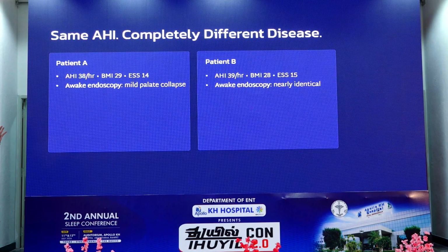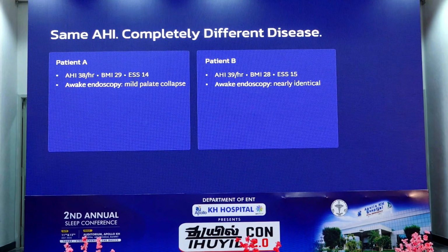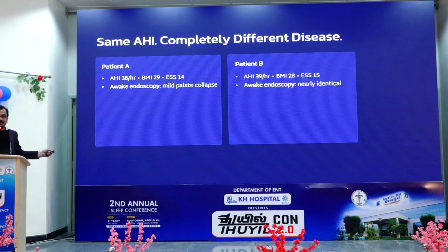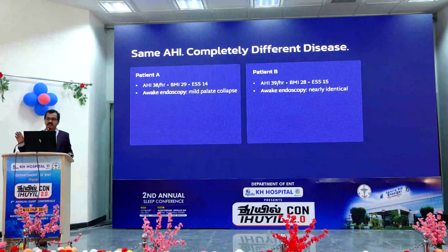Imagine two patients, patient A and patient B. They have almost the same polysomnographic findings, the same AHI, the same Epworth Sleepiness Scale scoring. When you have done a nasal endoscopy or a flexible scopy in the OPD, they have shown identical findings. But think about this: before the DISE era, you always used to do a UPPP or some kind of nasal surgery for all the patients. After the introduction of DISE into the sleep surgeon's armamentarium, we are now able to do site-specific, patient-specific treatment.